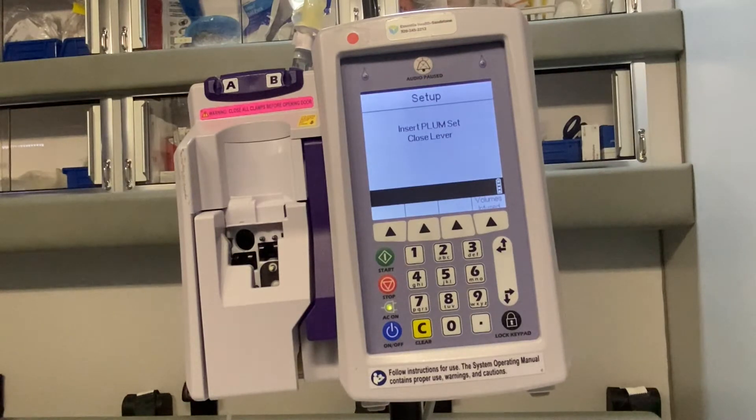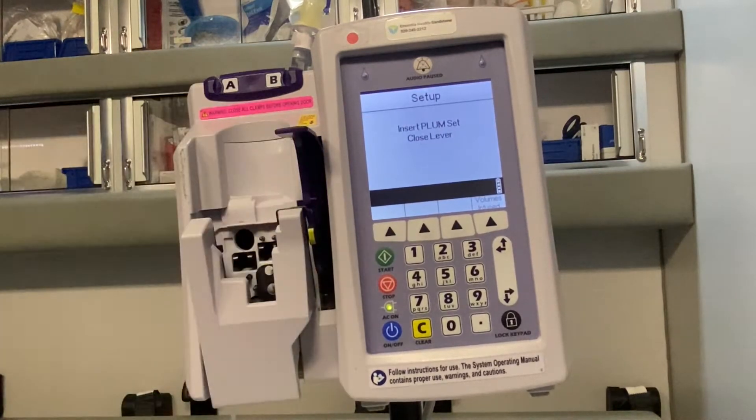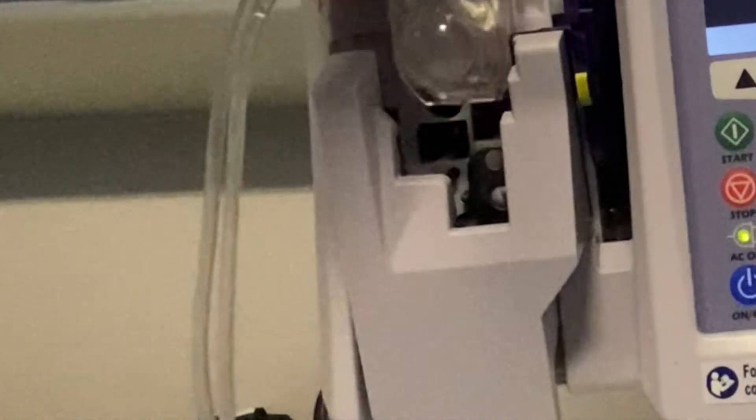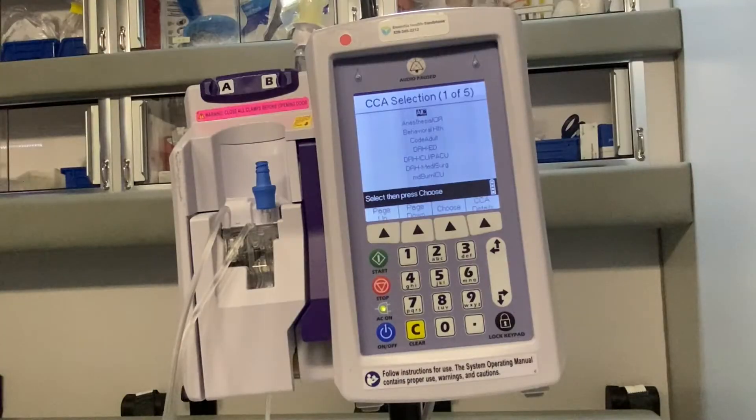Then we're going to put the cassette into our pump. We open the door with the lever, and this little white piece here needs to go into that hole there. So we line it up just right, pop the cassette in, close the door, shut the latch, and then it goes through a little self check.